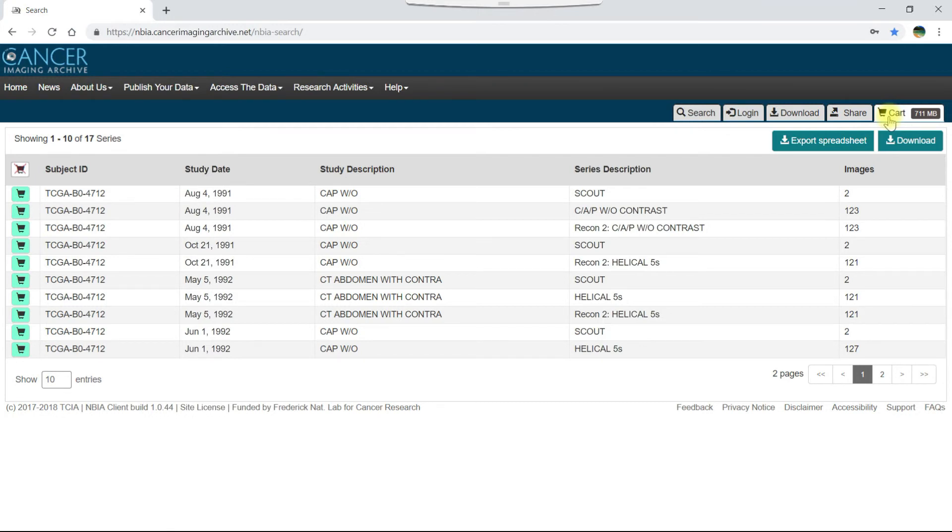The file size of the data appears on the tab. You can remove items from your cart by clicking the cart icon.